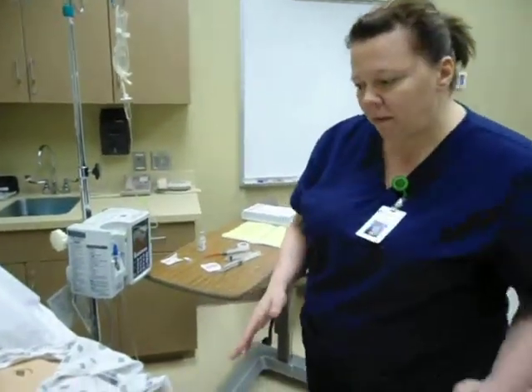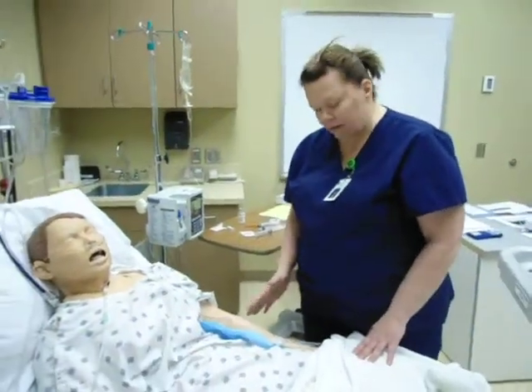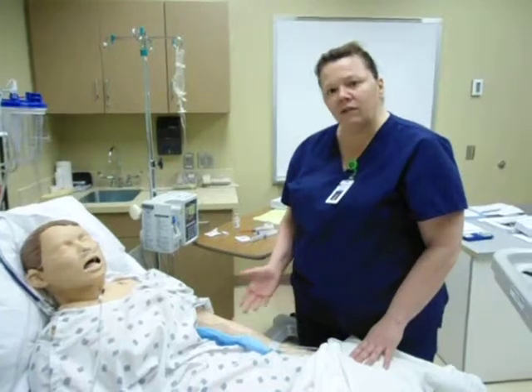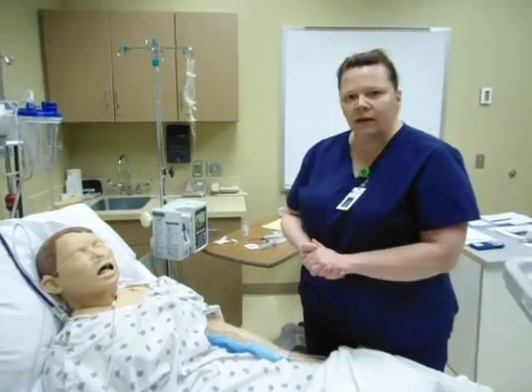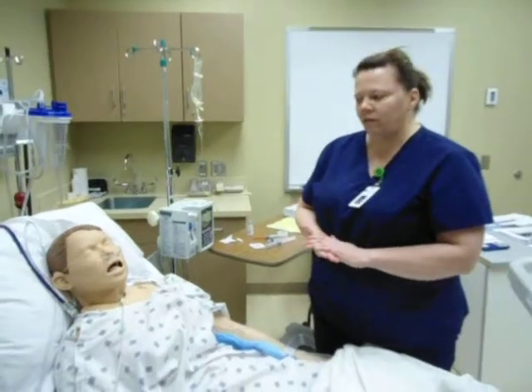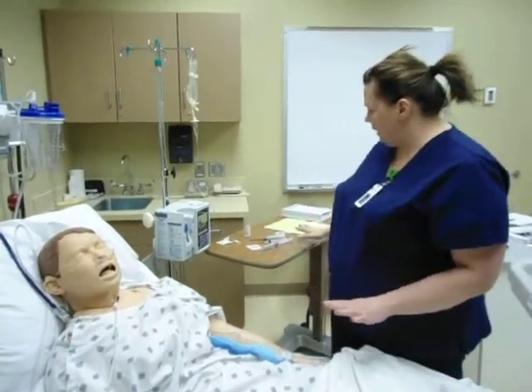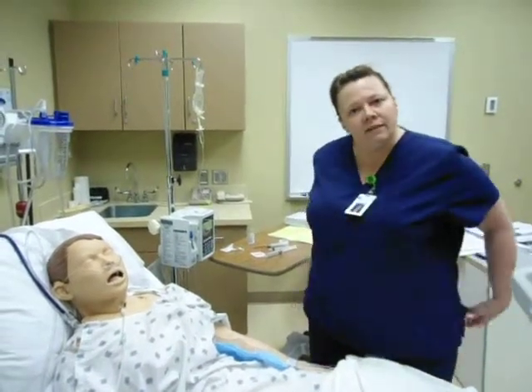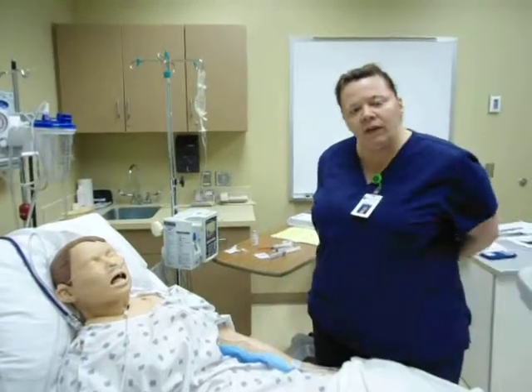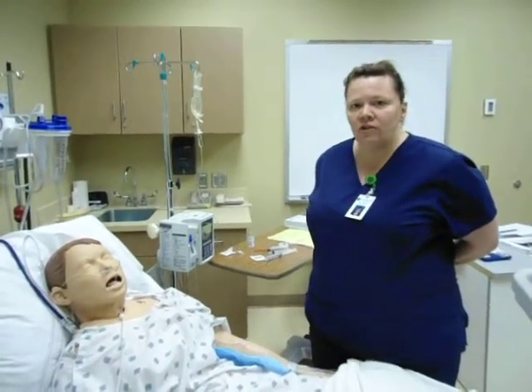And I'm going to check my patient and make sure that they are comfortable, and ask, while I'm giving it, how they're feeling. I'm just going to be assessing them and making sure that they're tolerating that medication well. And I'm going to make sure that I clean all my stuff up, and that is it. I'll come back in half an hour and assess the patient, and if they need more medication, I will give it again.